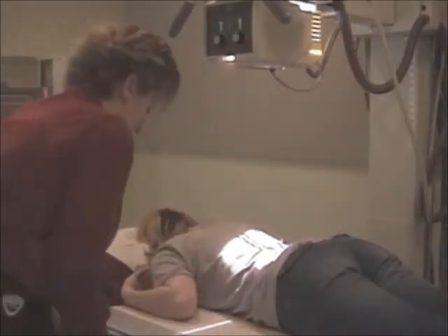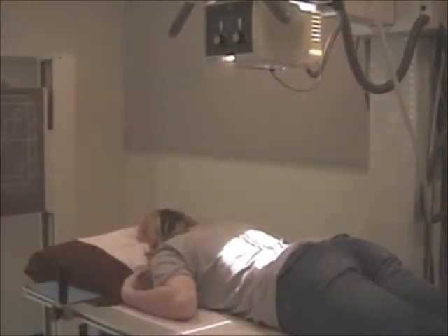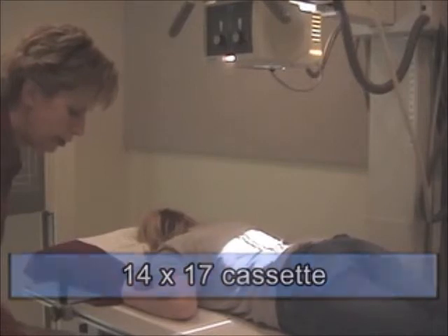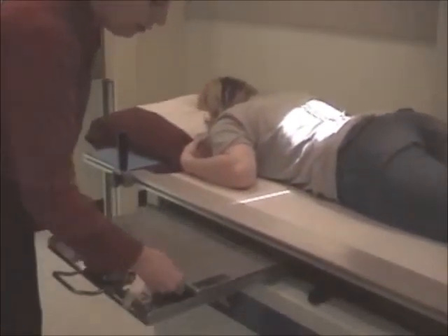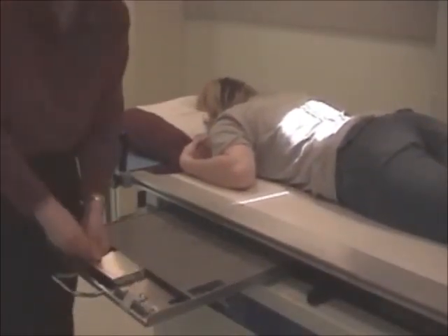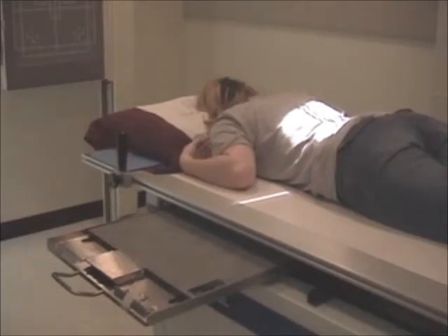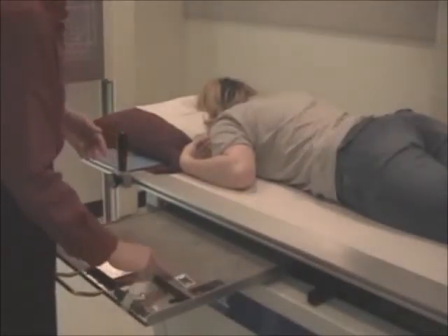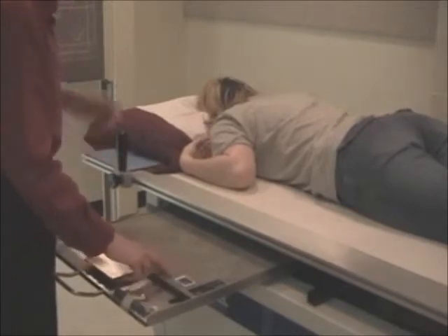Okay, so big film, we're going to put her MSP to the center of the film. I'm going to get her straight on the table. 14/17 cassette. The big films, you use markers. Little films, just initials. And I would actually mark how many minutes this was. I would have a 15-minute marker, say, here as well.